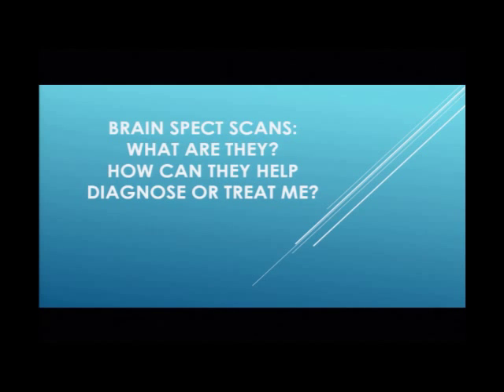The SPECT technology is not new. It's similar to what is done when you go for a stress test for the heart. It's called the thallium stress test, and they scan your heart with thallium, and they get slices, and I'm going to show you slices of the brain. And so we get different views, and I'll show you them in a minute.